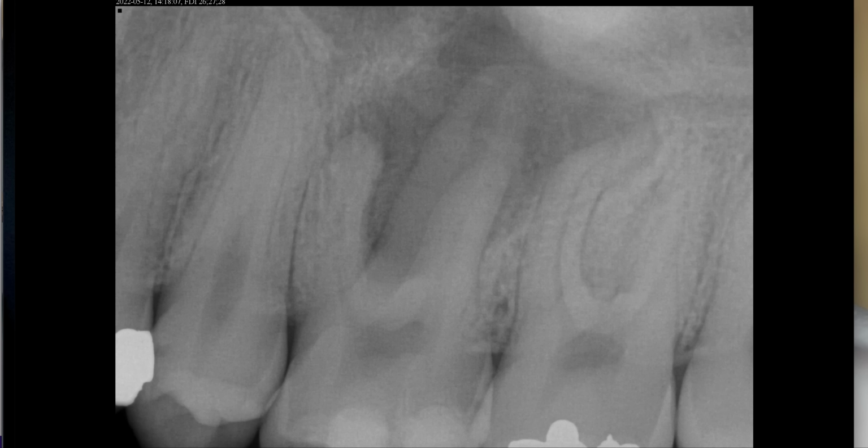The next case we're going to talk about is this large necrotic tooth, number 26 or 14. It was a large lesion, and I did not take a cone beam on this case. I elected not to. I don't think it would glean more information. Actually, it would probably make me deem it more non-restorable, like, wow, that's a huge lesion, we'll never heal it. So it was a large pulp chamber. If I couldn't find MB2, then we'd probably do that, and if we didn't get any resolution, then we'd grab a cone beam before we elect to extract and bone graft.